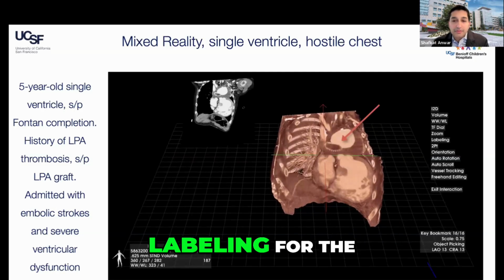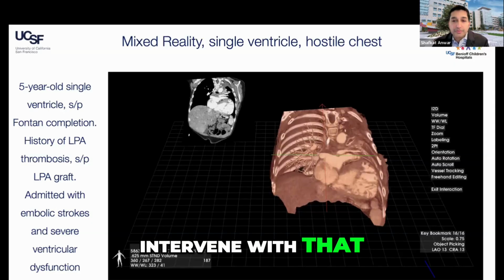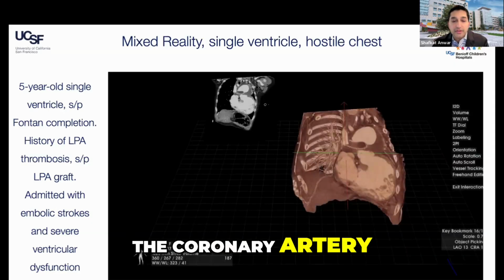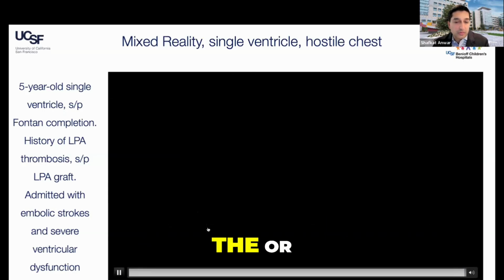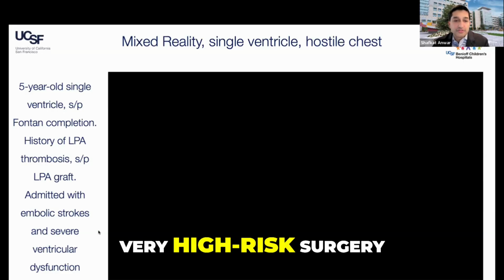Here, I'm basically labeling for the surgeons the areas that they need to intervene with: that LPA graft that's clotted, the large pseudoaneurysm, the coronary artery. I mean, this is just a minefield. We gave the family a 50% chance of death in the OR. And so, very high risk surgery.